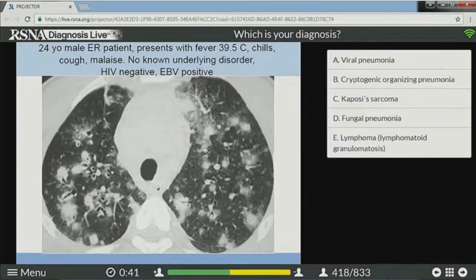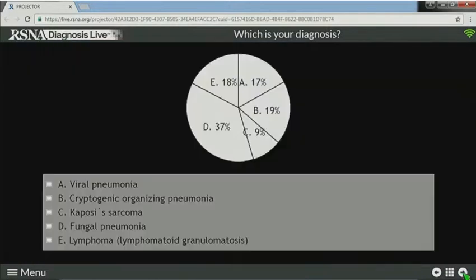So let's aim again at 450. Push button. Okay, almost there.